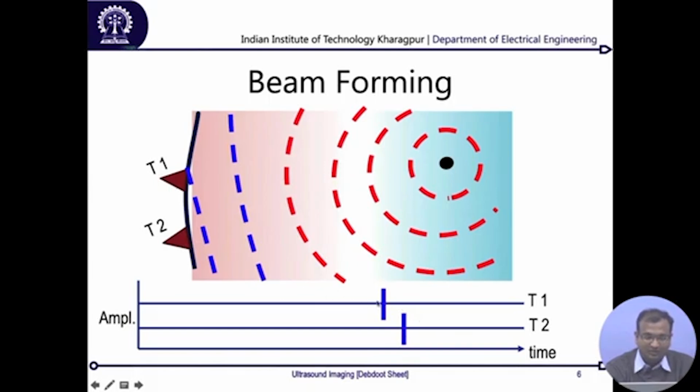Now, we need to keep in mind that by looking at these time delays of subsequent ones coming down, say if there are T3, T4 eventually, there would be subsequent delays over there, whereas if there is another transducer over here which is called T0, then that would be preceding T1 in the pulse arrival. So, looking at all of them together, there should be a way in which we can estimate in the 2D space where this particular point is located.